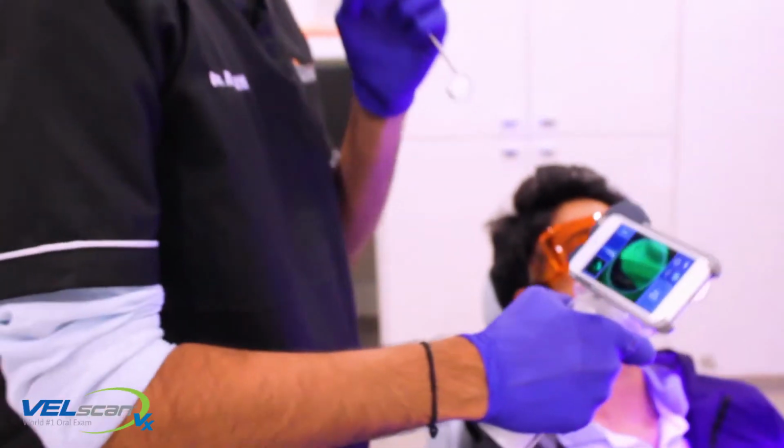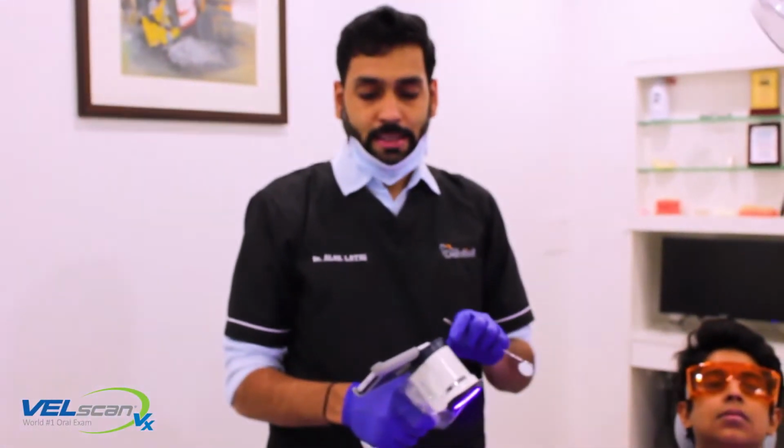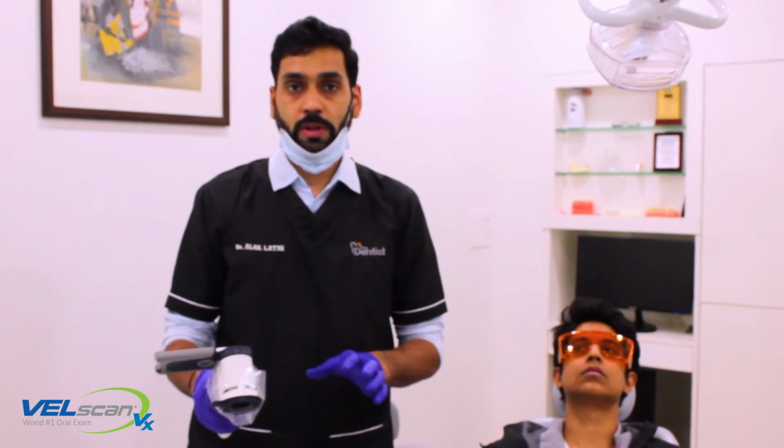So why do we need this device to be used along with the white light? The simple reason is, if under the epithelium some things are developing, which may take a few years to surface, they can be captured by the VELscope well in time. And that's how it's going to be important to keep our patients safe and help in diagnosis of lesions which are not seen by the naked eye. So that is the usefulness of this device called VELscope.